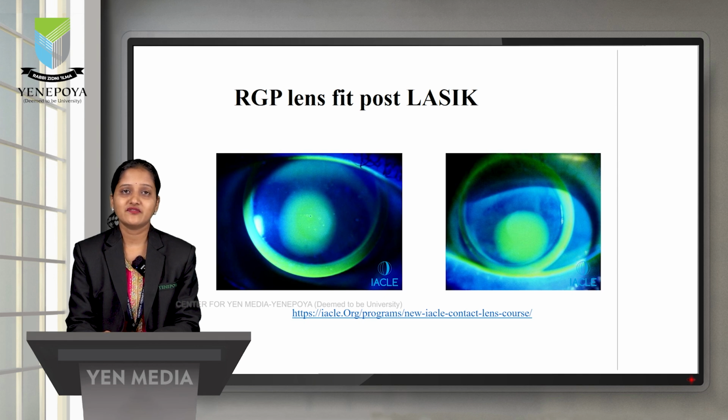This is a typical example of an RGP lens fit post LASIK, where we can see central pooling, a mid-peripheral mild touch and a thin edge clearance.